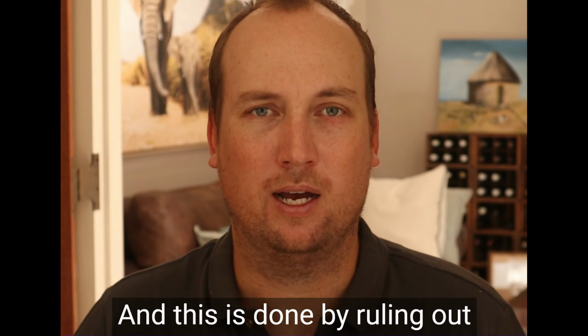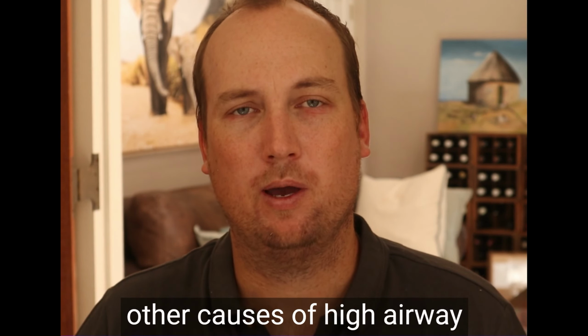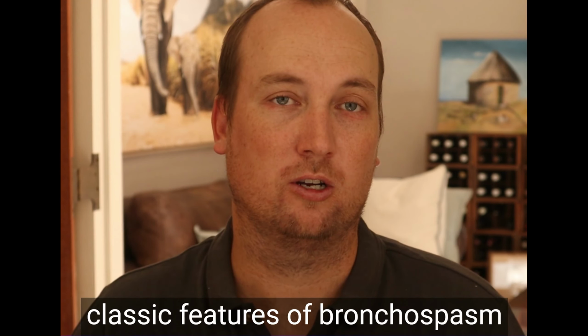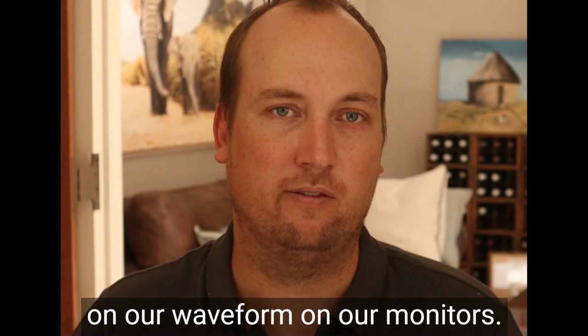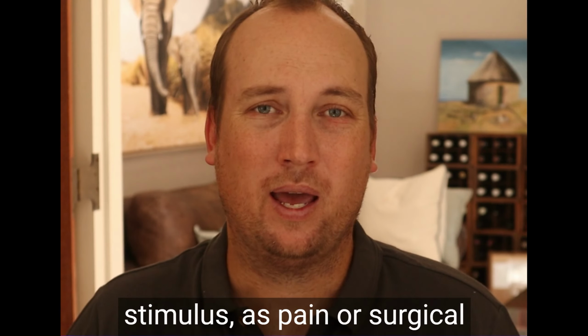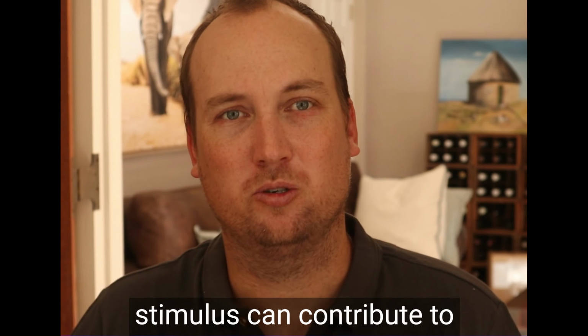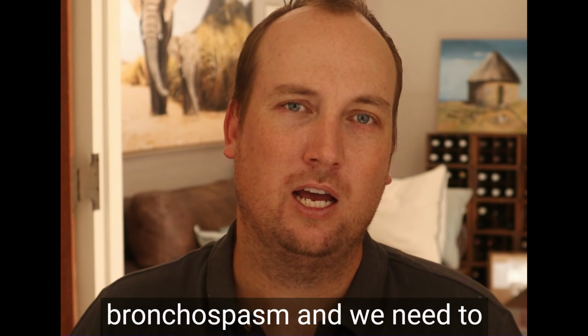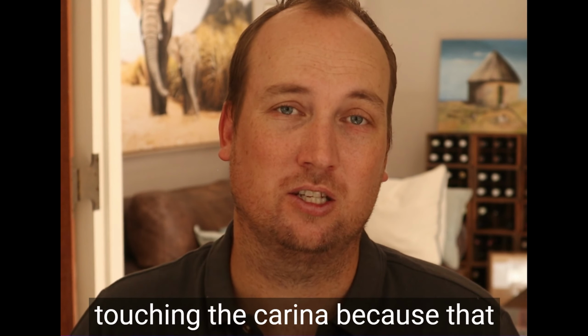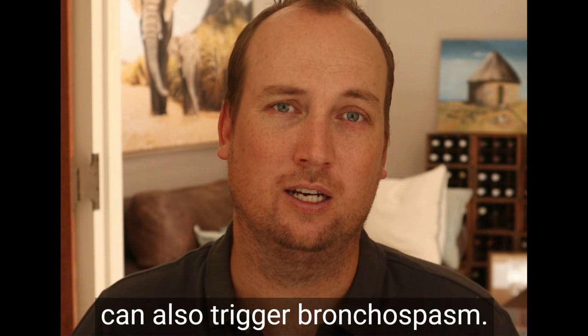And this is done by ruling out other causes of high airway pressures, but also seeing the classic features of bronchospasm on our waveform on our monitors. We need to stop the surgical stimulus, as pain or surgical stimulus can contribute to bronchospasm. And we need to make sure that the endotracheal tube is not too deep and it's not touching the carina, because that can also trigger bronchospasm.